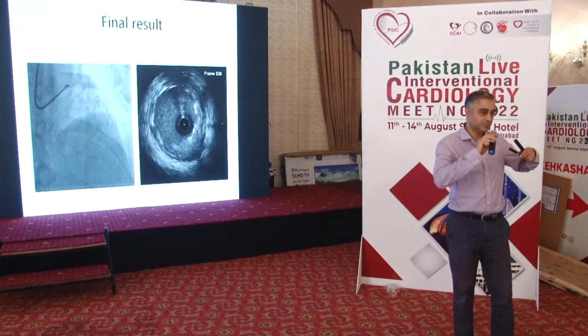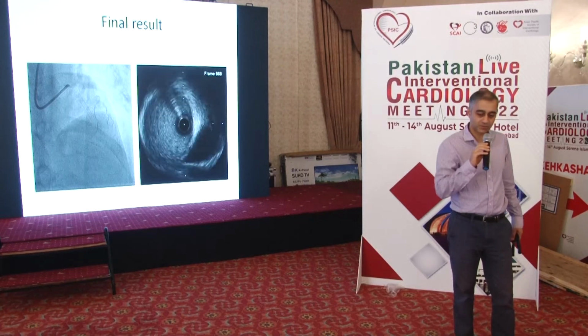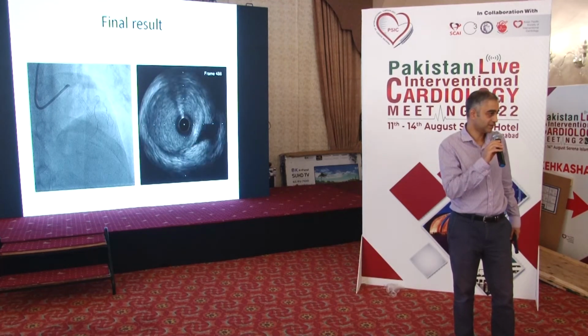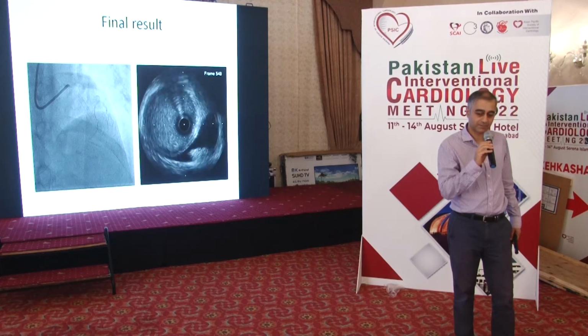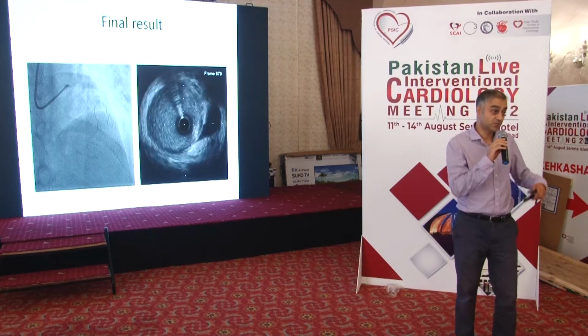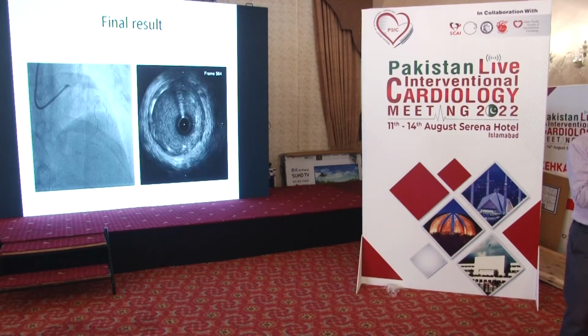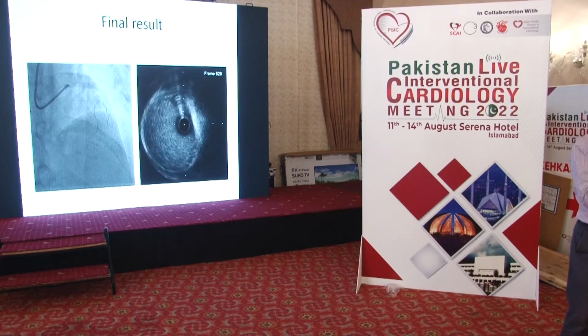All you're going to do is push your stent out further, squash the plaque up against the vessel wall. And it's looking better now, isn't it? Certainly from an angiogram perspective and IVUS perspective. But actually, you could have left it as it was. Some operators would do that. I just felt that actually we need to open this out a bit.